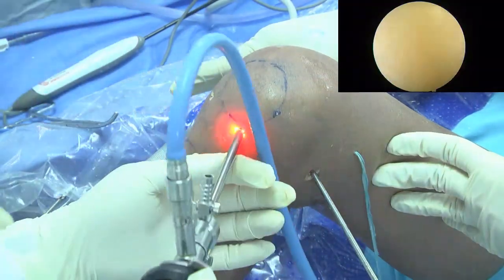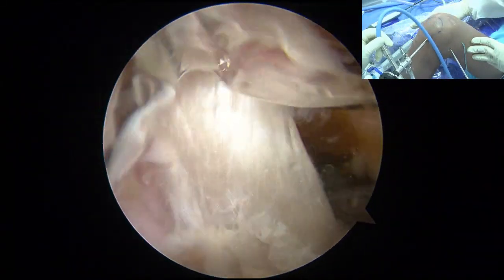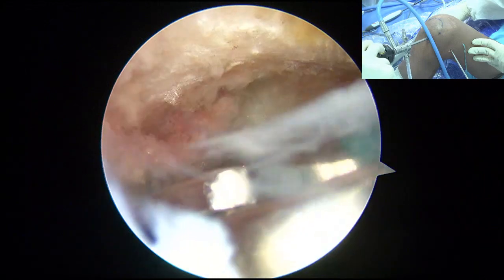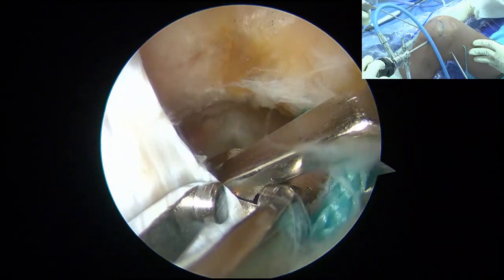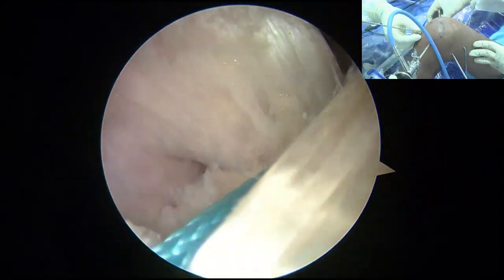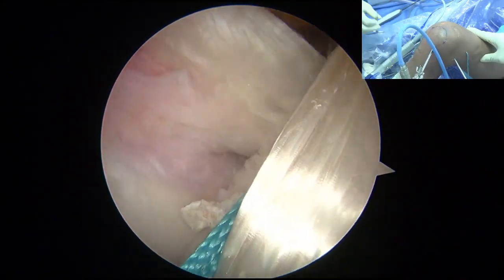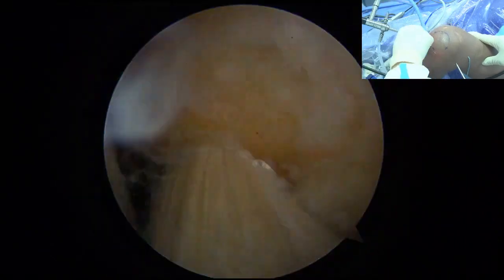Okay. 这个好，yeah, yeah. 好啊，这个很好。对了。Okay, good. So now you have this, right? Suture retriever. So Professor Adinan is pushing this to the center. Okay, here, you take this out. Very good. This one. Okay. So this way. Okay. Good. Lock it. So now you go between ACL and PCL, right? The next step is to shift your camera from here to the medial side.